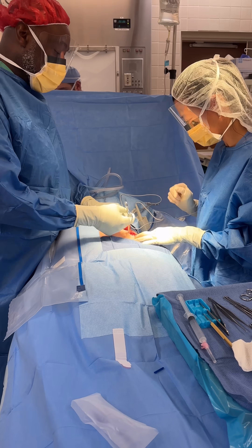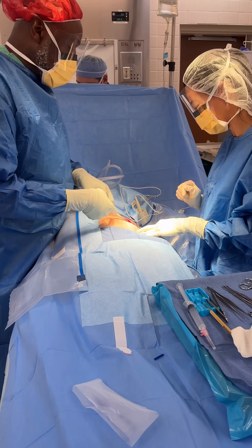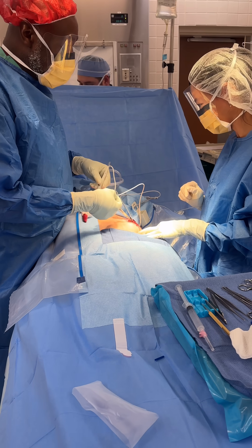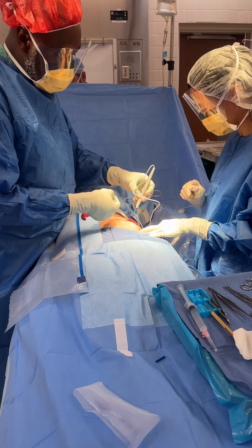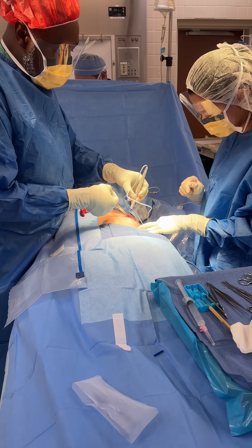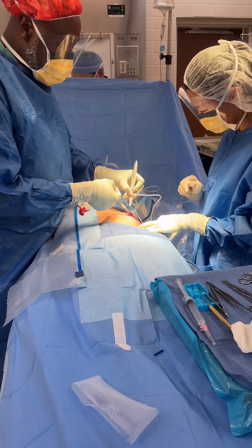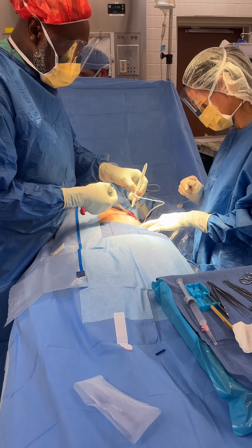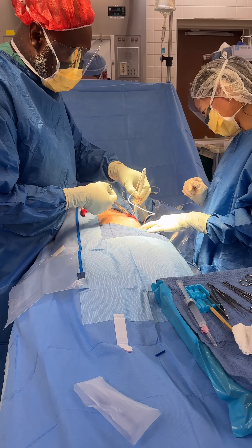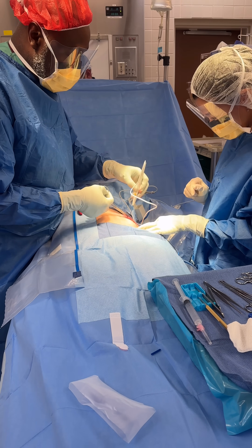How about this — I'm going to show you one side, you use the other. So I'm going to take that, grab it like this. See, I'm picking it up so you can go through all the way. We're going to go a little more. We're going to come around. I'm going to take this and go straight down.